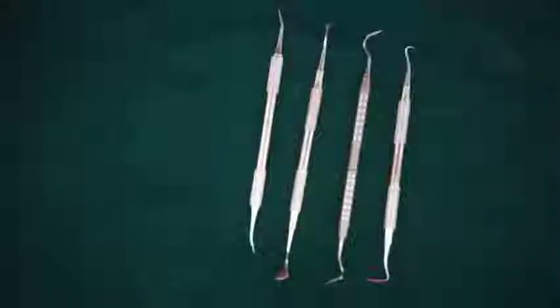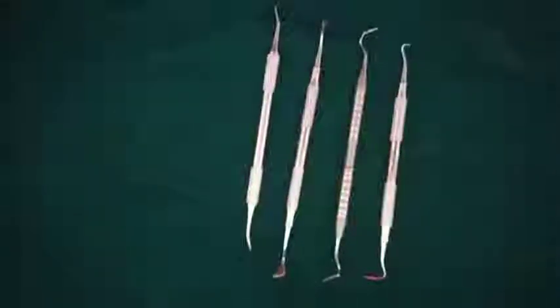Good morning. In today's tutorial, I will be talking about periodontal knives used in periodontal surgery.